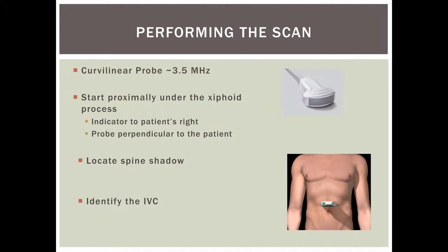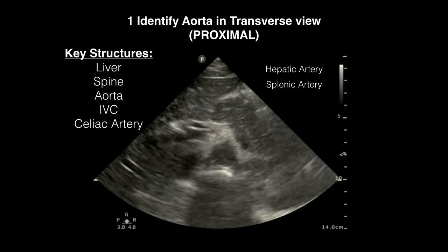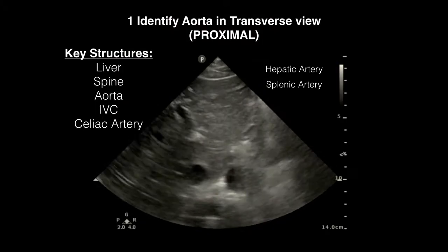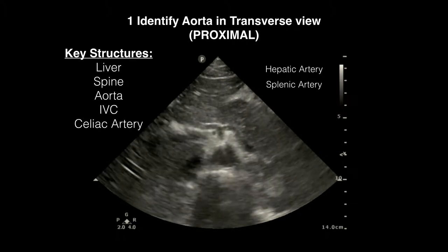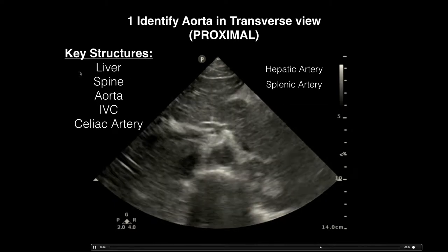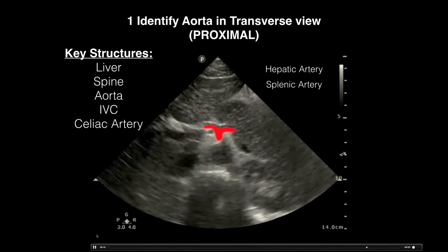When performing the scan, use a curvilinear probe or a phased array probe if a curvilinear is unavailable. Start right at the sub-xiphoid area with the indicator towards the patient's right side. The first view is the proximal aorta in transverse. The key structures you'll see are the liver, spine, aorta, IVC, and celiac artery. The liver serves as an acoustic window so you can see the descending aorta, and the abdominal aorta will be located between the liver and the spine.